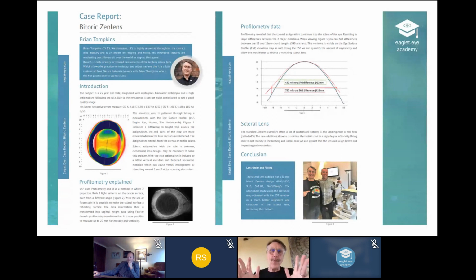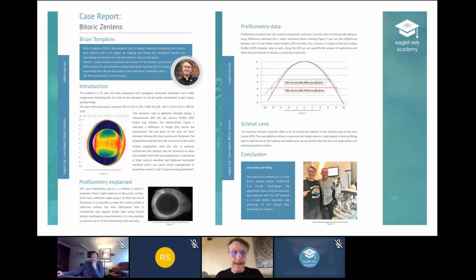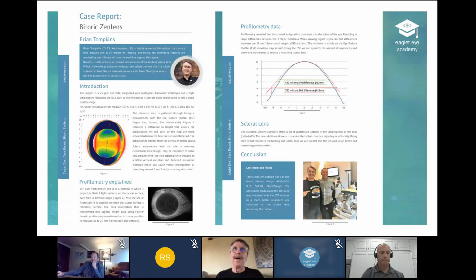And once we got that image, I sat down with Reinier and we did a couple of links on the technology at the time, which was before the Zoom explosion that's gone post-COVID. And we talked through the best options, and his best advice at that time was to get a bi-elevation, bi-toric in those days, now bi-elevation. And we sent that data to the laboratory. In the UK, we're using the Bausch laboratory, logically, for Zenlens, and ultimately they said, yeah, fine.